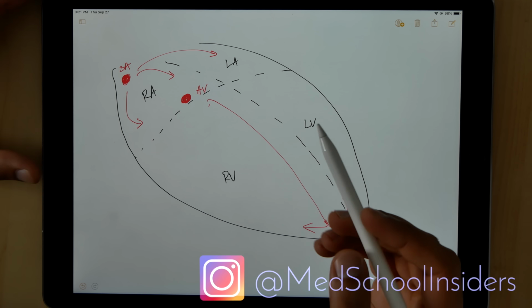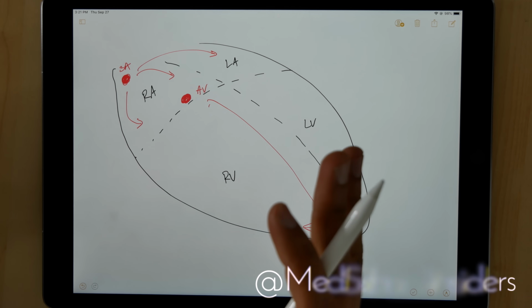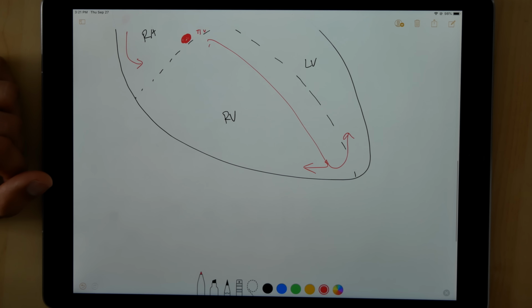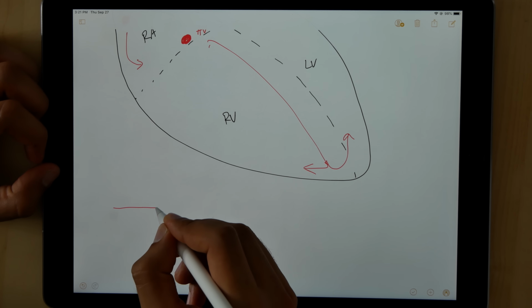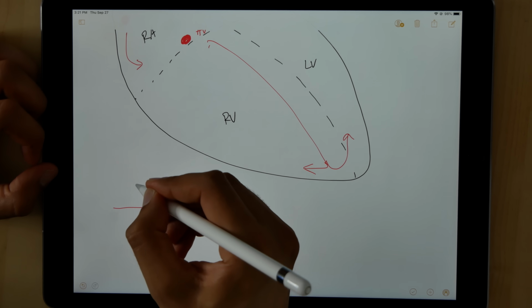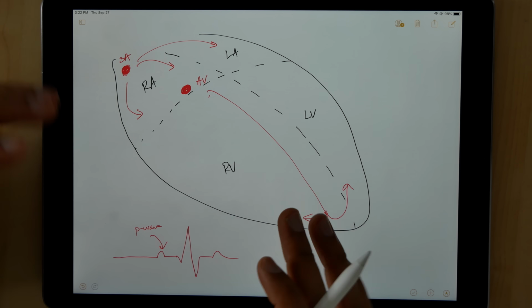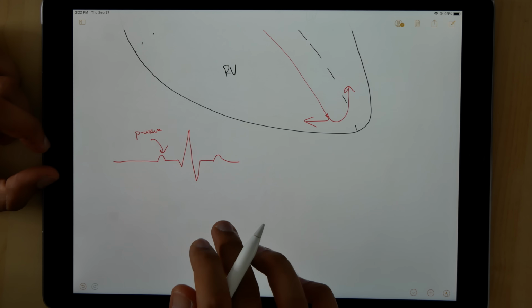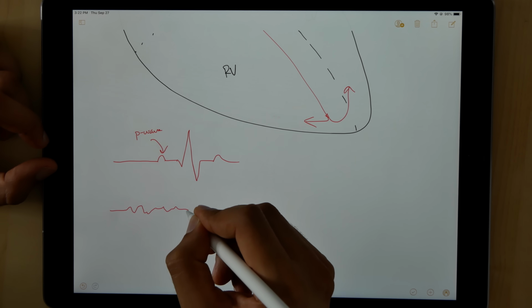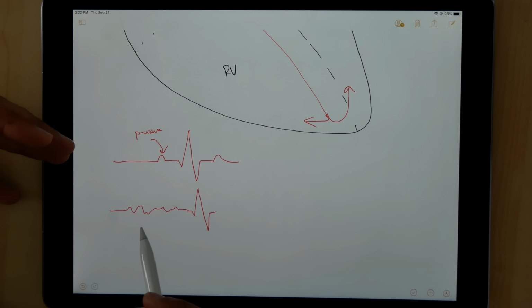Now in atrial fibrillation, your smaller atria, these 2 upper chambers in the heart, aren't contracting properly. They have this very irregular fibrillation pattern. If you look at an ECG, a normal ECG has a little P wave, and then you have the ventricles contracting. This is the P wave, and this represents the 2 atria contracting in a coordinated fashion. What happens in atrial fibrillation is you have these irregular signals, so you don't have a P wave. That is what the Apple Watch ECG is looking for.